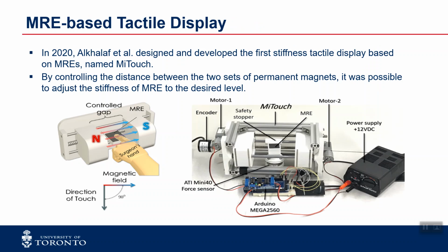MRE-based tactile display: in January 2020, the first MRE-based tactile display was proposed, which you can see its schematic on the left-hand side, and on the right we can see the actual design of this MRE tactile display.